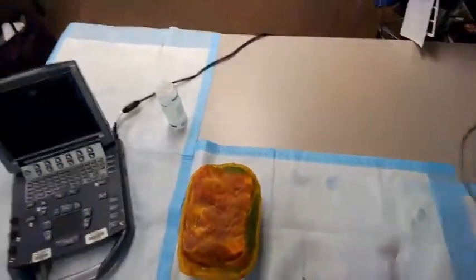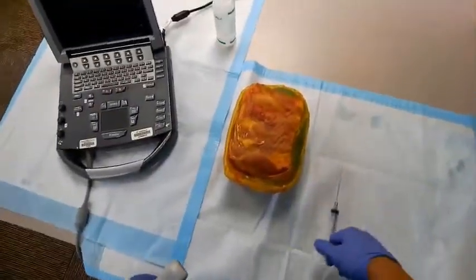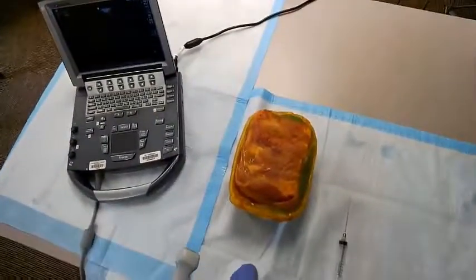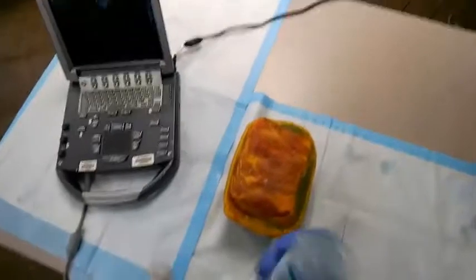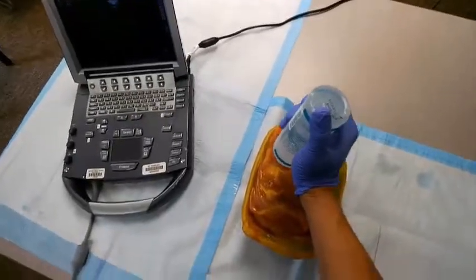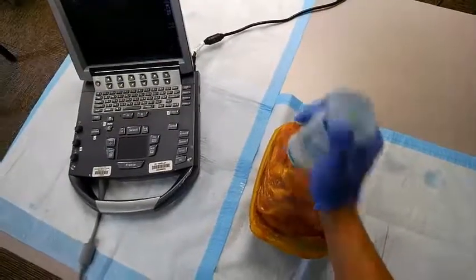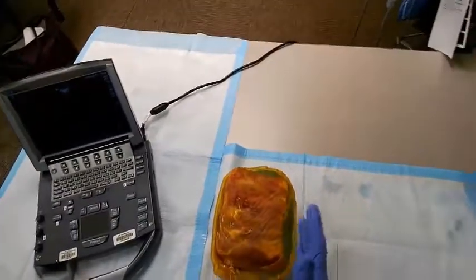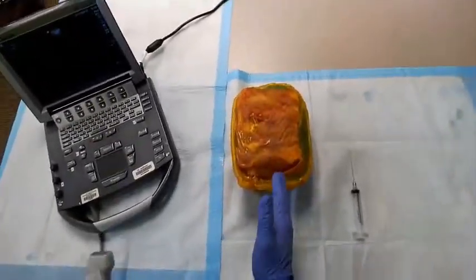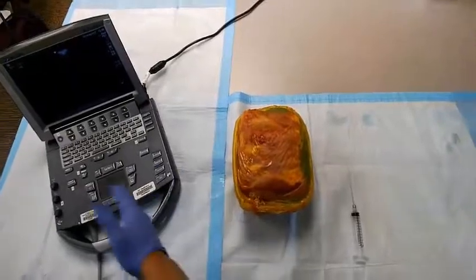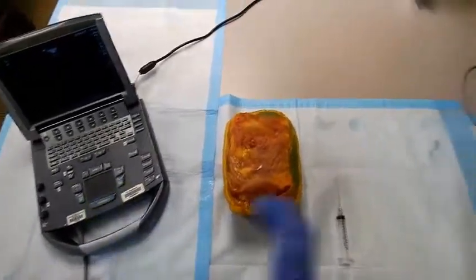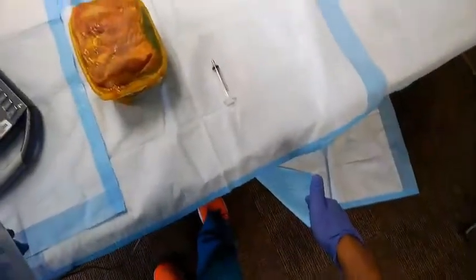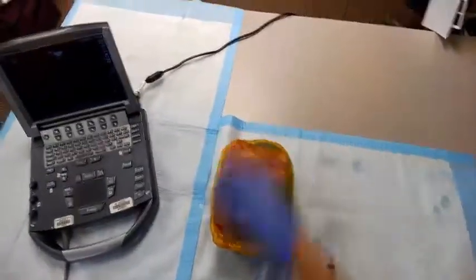This model has the capability to do two different views, including parasternal long and sub-xiphoid. This is the patient — this is the left side of their body, the right side goes towards this direction, their left arm would be over here, their hip would be down here, and their head up towards the top.